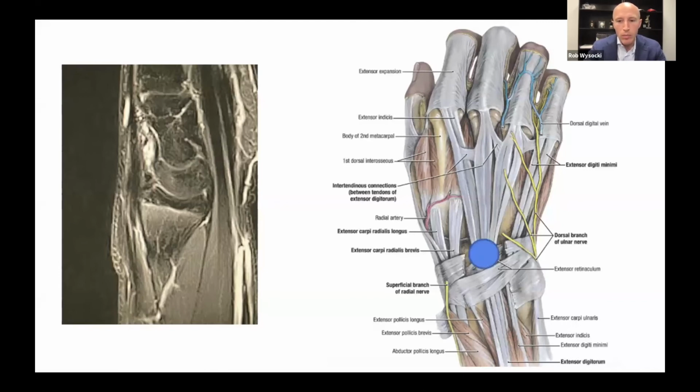And then I'll put a retractor between any of the digital extensors to get down to the dorsal capsule. And usually a release of just maybe the distal 30 to 40% of the retinaculum is enough just to be able to get access to that distal part of the SL right where it meets the mid-carpal joint for the resection, at least open. So I'll probably pause there.